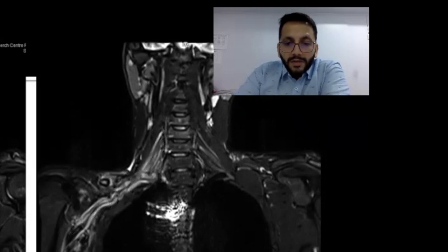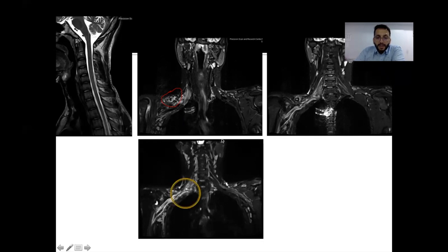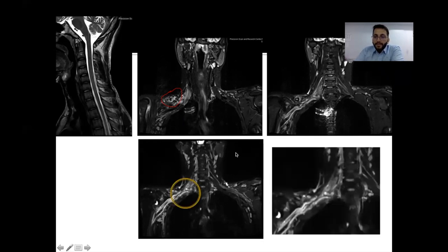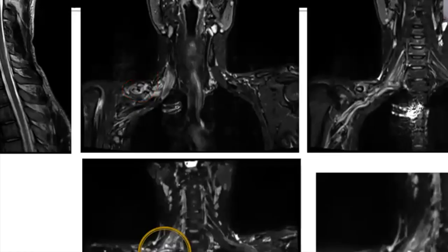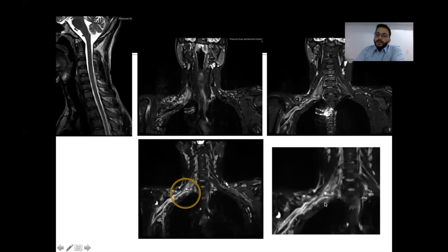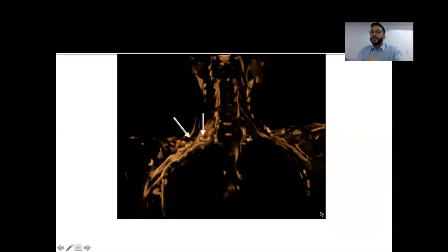On volume rendering and zooming in, it is clear there is a complete transection of a nerve. This is the middle trunk of the brachial plexus showing complete loss of continuity — a nerve transection — which requires surgical repair. The rest of the nerves in the brachial plexus show changes of edema or neuropraxia. So this patient has transection of the middle trunk of the brachial plexus and is definitely a candidate for surgery.